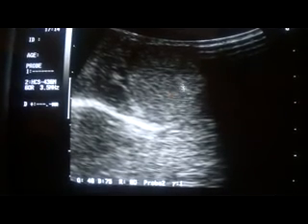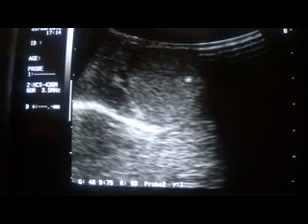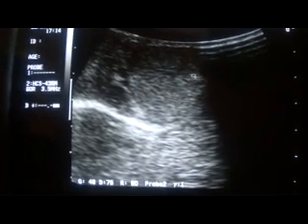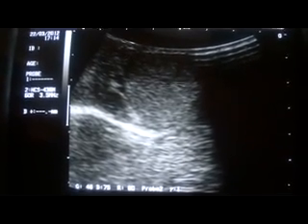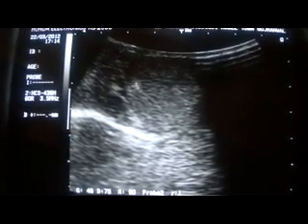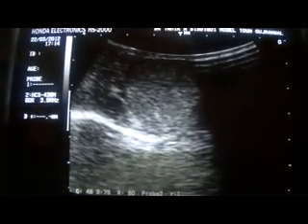This is the right testis, and this is not a mirror image of the right testis — rather, this is the left testis. This is a coronary view. Both testes are normal.